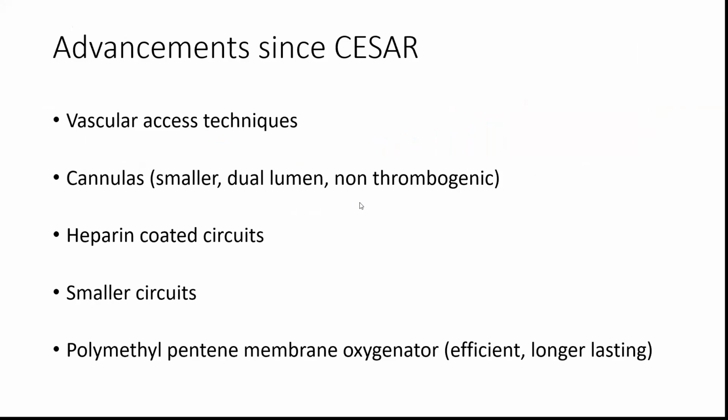In the protocol analysis, when they looked at the patients who actually got VV ECMO versus not, was the benefit still maintained, or did it dissipate? Say that one more time. So when they looked at the patients who actually got VV ECMO, and were transferred to that center, versus the patients who didn't get VV ECMO, was the benefit still evident, or was it just the transfer? No, it was just the transfer. Yeah. So there was no statistically significant difference in mortality with just ECMO versus patients that remained at the other facility. Does that answer your question?